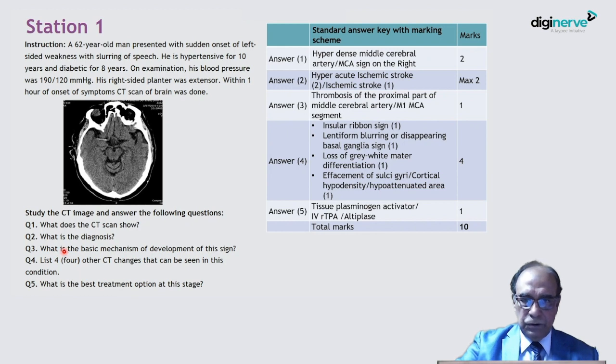What is the diagnosis? This is the earliest sign of ischemic stroke. So this is diagnosis hyperacute ischemic stroke. If you say ischemic stroke you will get the half mark. If you write hyperacute then you will get full marks. If you write only ischemic stroke you will get 1, if you write hyperacute ischemic stroke you will get full marks, that is maximum marks.